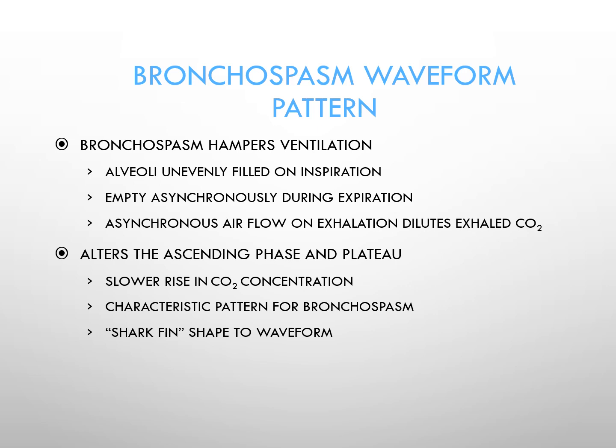So focusing a little more in depth on what happens with the bronchospasm waveform. Again, to remind you, I referred earlier to the shark fin shape that may accompany a severe bronchospasm if a patient has end-tidal CO2 monitoring in place while they're having the bronchospasm. So think about what happens. The alveoli unevenly fill on inspiration. They also empty asynchronously, or unevenly, during expiration. So you get this asynchronous airflow on exhalation, which dilutes the exhaled CO2.